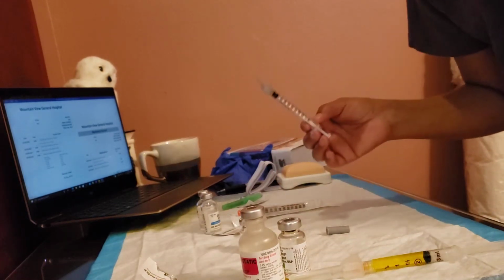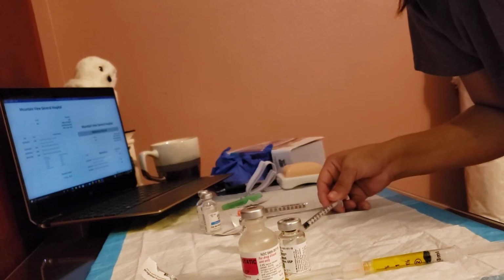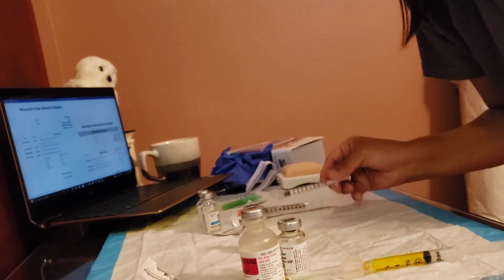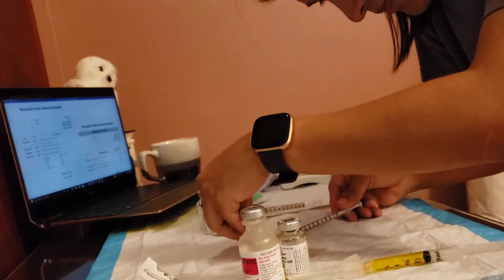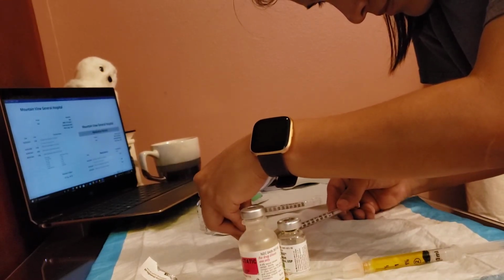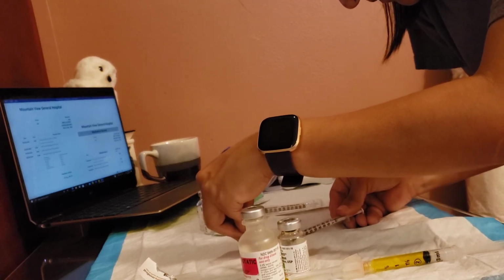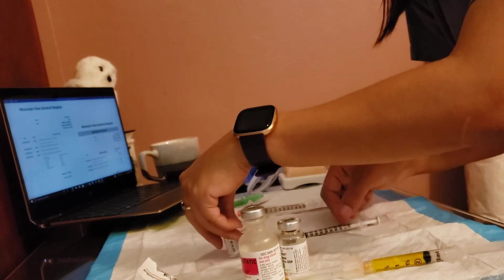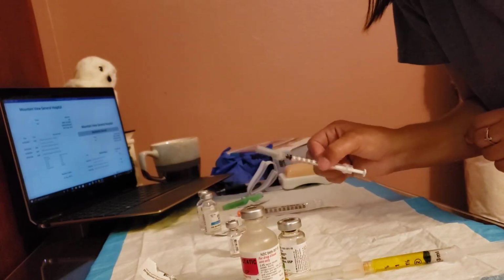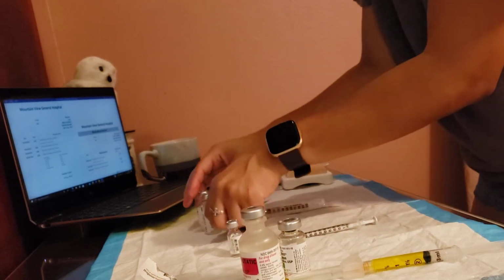And I'm not going to safety it because, again, I'm going to use the same needle. So I'm going to come here and very carefully close it against a hard surface. Okay. So my TB is ready. I have 0.1 in there. Now we're going to move on to my insulin.